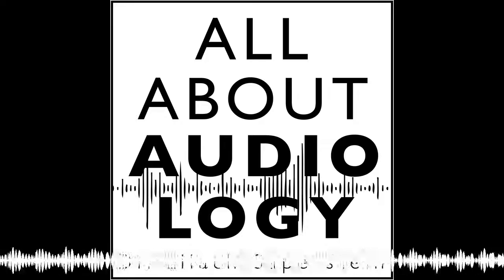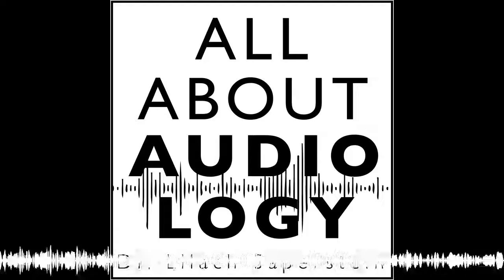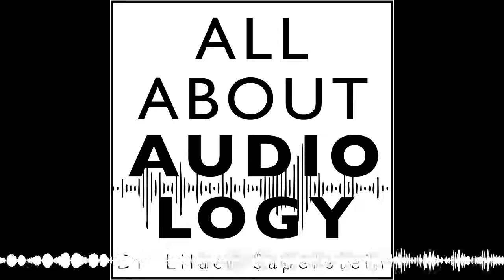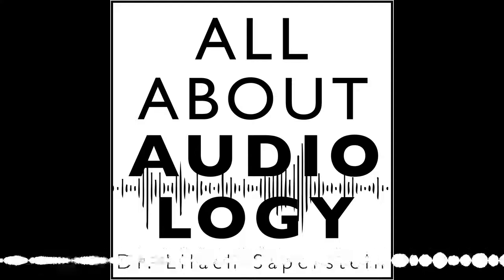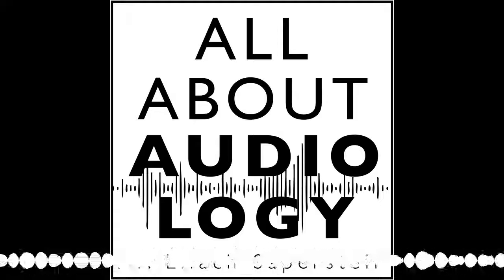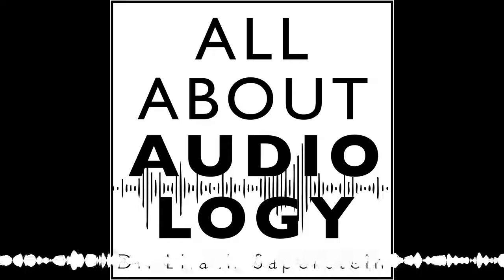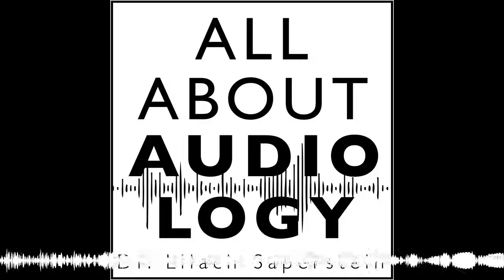Thanks again for listening to the All About Audiology podcast. I can't wait to hear what you thought of this episode, what other questions you might have about the various equipment we use in audiology. And I actually received a DM from one of you on Instagram who asked me to talk about REM, which is real ear measurement. That's another kind of equipment and software that we use when testing hearing aids and when making sure that the hearing aids are programmed adequately. And that's a really interesting technology that lets us know that what the hearing aid is putting out, the sound coming out of the hearing aid, is exactly right for each person's precise ear shape, the length of their ear canal, right? The way the hearing aid fits in their ear. So it's a very specific and personalized kind of fitting.